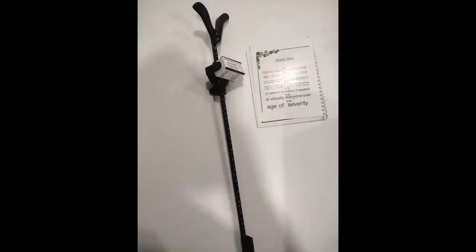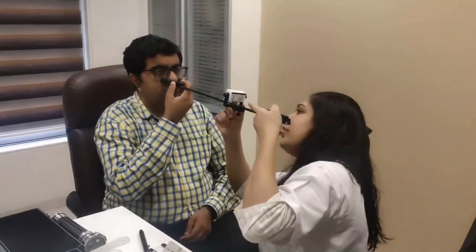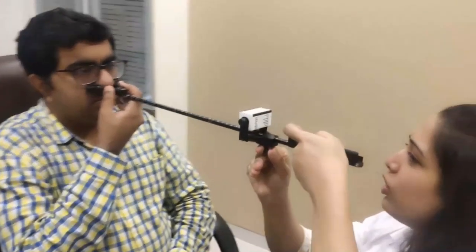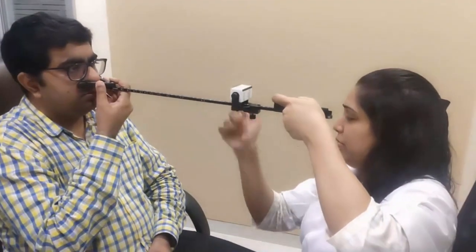Let's check the near point of accommodation and convergence. Please put this on your nose. Can you see this dot? Yes. Okay. You have to look at the dot and the line. I will bring this closer slowly. When it appears to be double, you have to let me know. Okay?